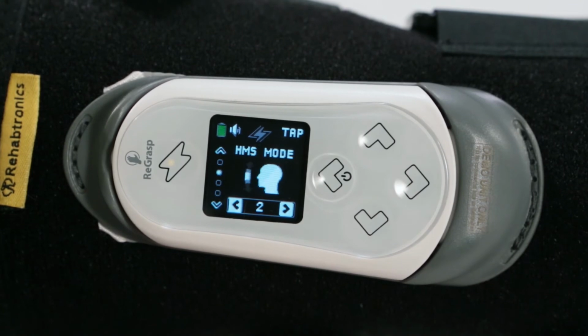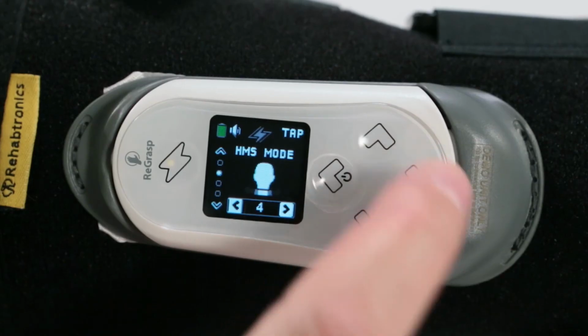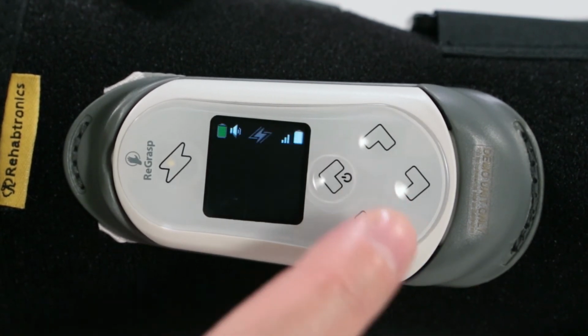You can also try motion number 2, up, down, number 3, to the right, or number 4, to the left. Choose the motion that works best for you. To exit, scroll to the end of the list to exit and return to the main menu.